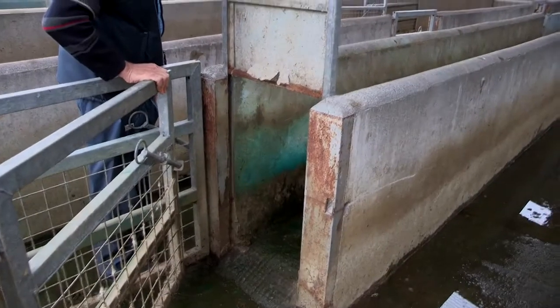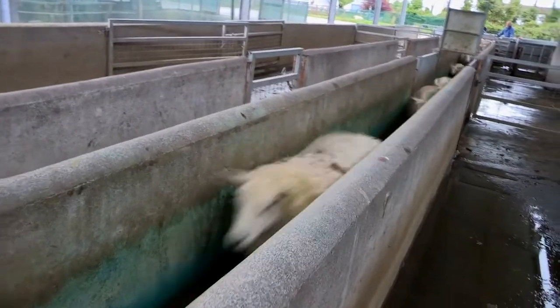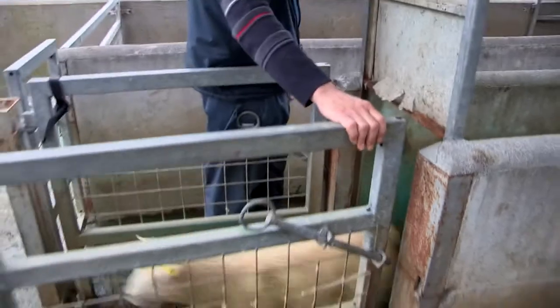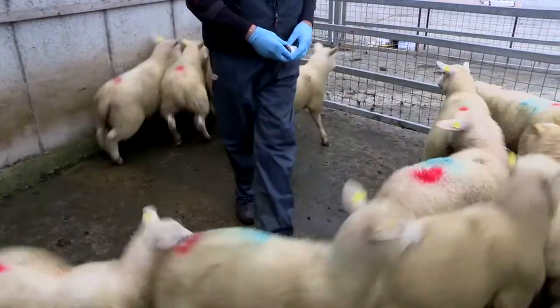Select the same 15 lambs that were tested at stage 1 and place them in a clean pen as soon as possible after gathering. They would have been marked at the time of taking the first test 1 to 2 weeks earlier. Leave them a short time to defecate.